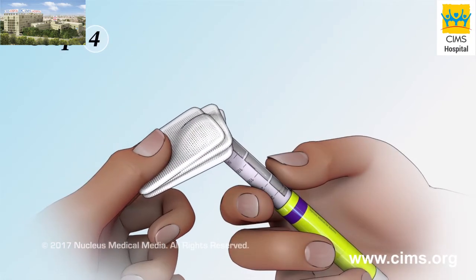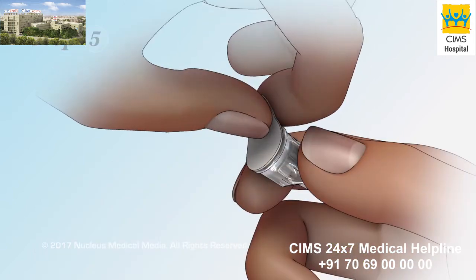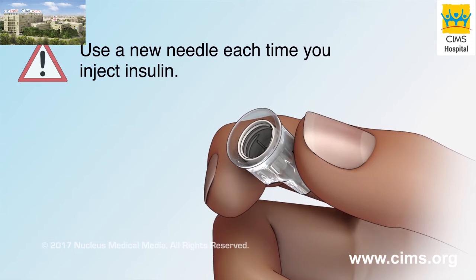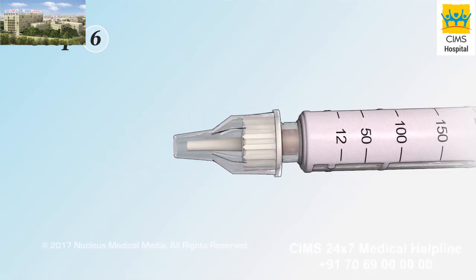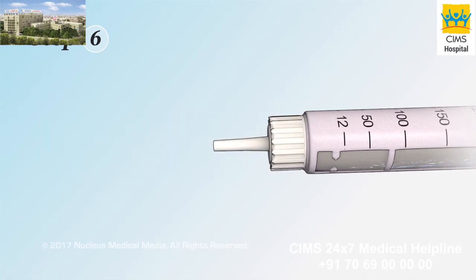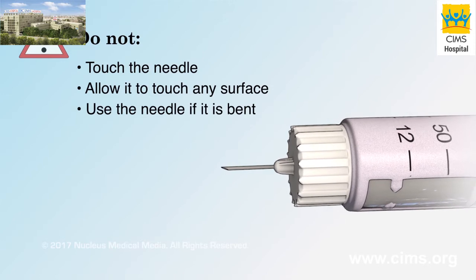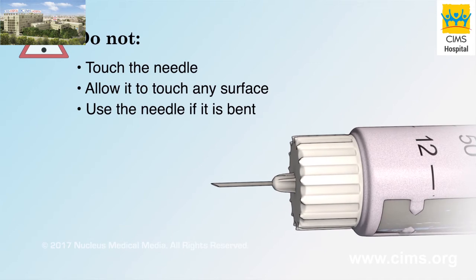Step 4: Use an alcohol wipe to clean the end of the pen where the needle attaches. Step 5: Remove the pull tab from the needle. Be sure to use a new needle each time you inject insulin. Step 6: With the outer and inner needle caps still in place, attach the needle to your pen according to the instructions. Remove both the outer and inner needle caps. Do not touch the needle or allow it to touch any surface, and do not use the needle if it is bent. A bent needle can block or prevent the insulin from coming out.